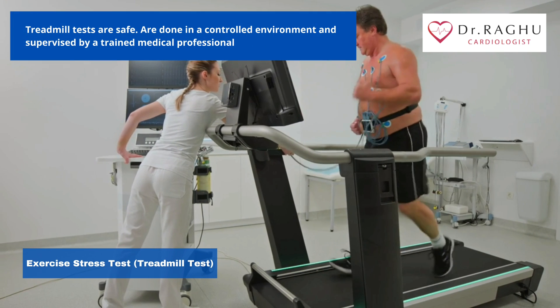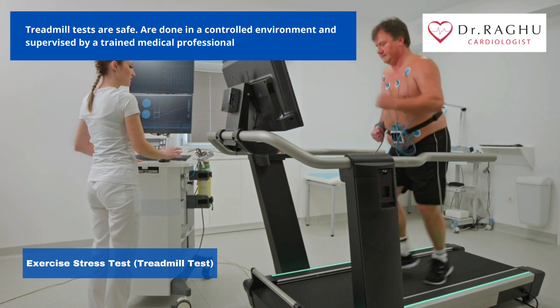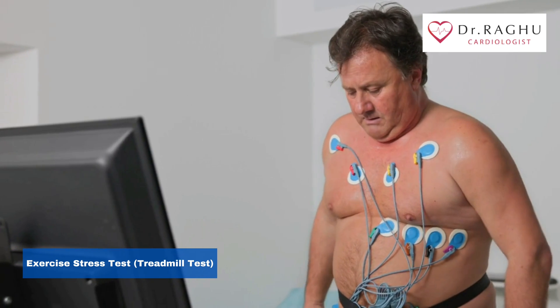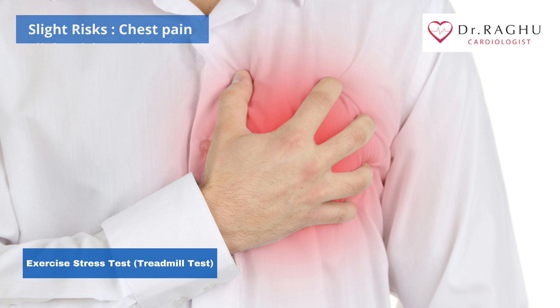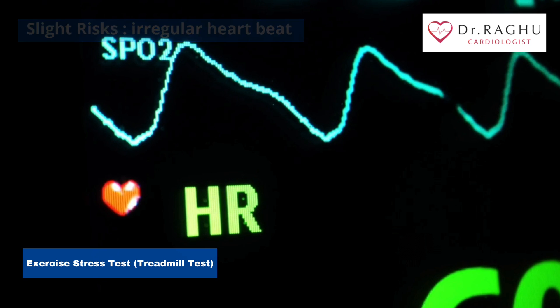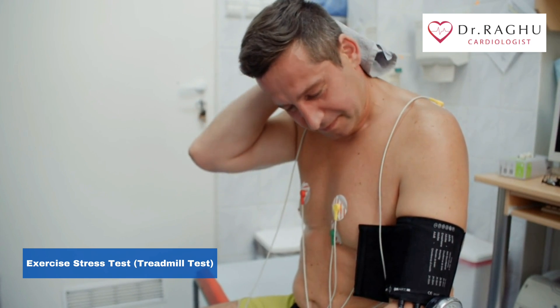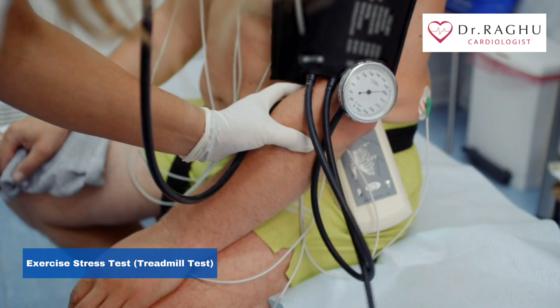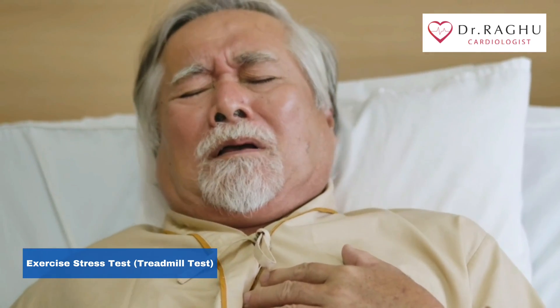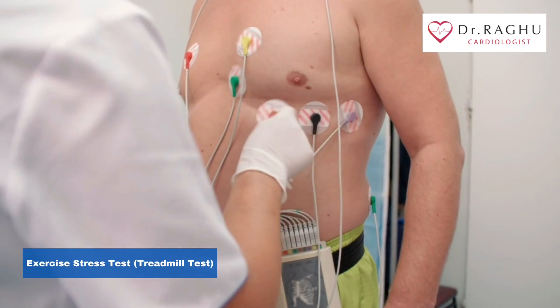Stress tests are generally considered safe, especially since they are done in a controlled environment under the supervision of a trained medical professional. However, there are some rare risks, such as chest pain, collapsing, fainting, heart attack, and irregular heartbeat. However, your risk of experiencing these reactions during the test is low since your doctor will screen you for problems beforehand. People who run the risk of these complications, such as those with advanced coronary heart disease, are rarely asked to do the test.